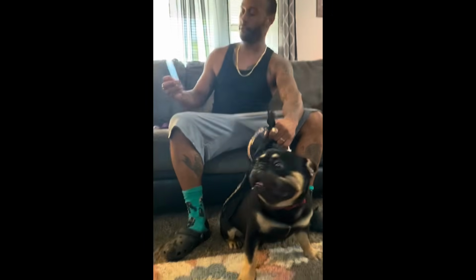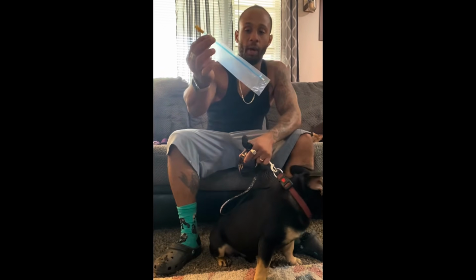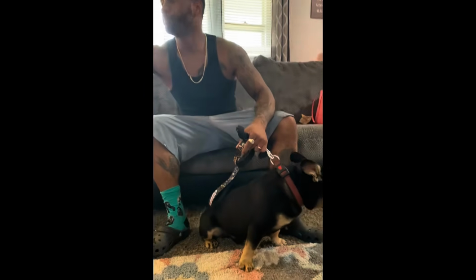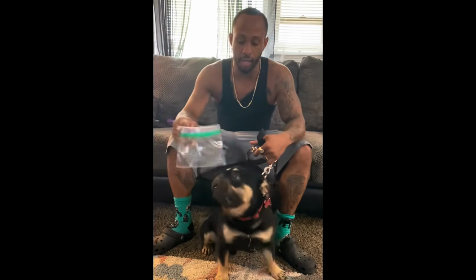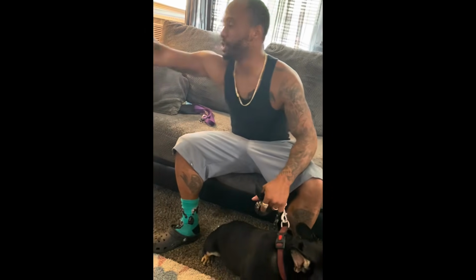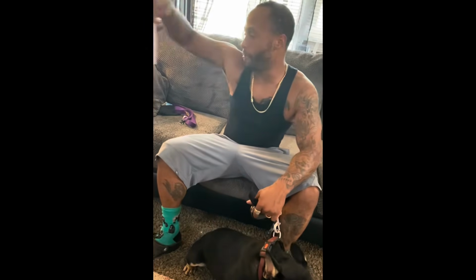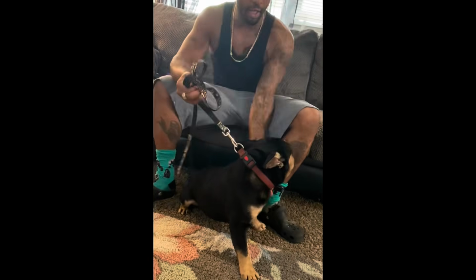Now, if you're wondering, these catheters are what we use to actually AI our dogs. This catheter, about up to here, will reach the uterus. You want to make sure you get it up to that point. I don't use anything specific to actually get his sperm. I use an ordinary sandwich bag and put it around him, let him smell her a little bit, and do the works. Once he collects in here, I use this catheter with this syringe, and I collect his sperm in that. Then I bring the female here, and I administer the artificial insemination. So let's go ahead and get Dolly in here so you guys can see her and check out this process.